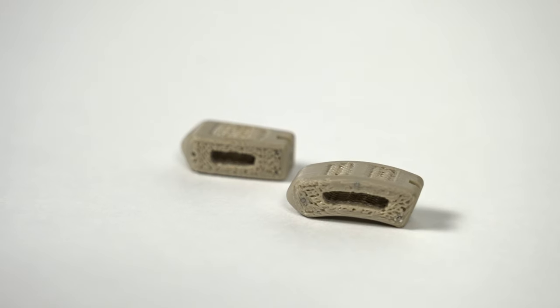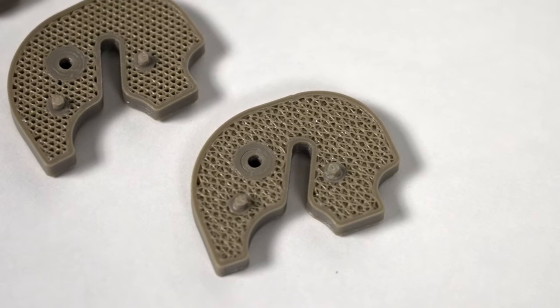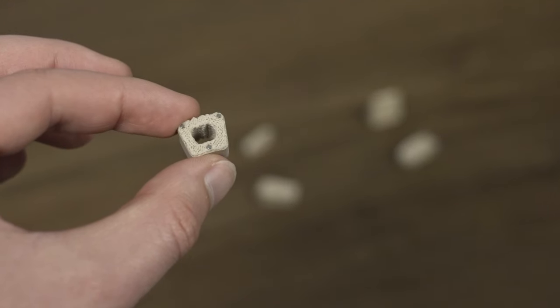But there are some other hurdles to clear here too. Maybe the most interesting is that PEEK is kind of a tricky material to 3D print with. Here's the issue. With PEEK, the melt temperature and the crystallization temperature are far apart. That means the normal method of deposition style 3D printing, melting material and laying it down, just wasn't going to work. Printing PEEK has many pitfalls.